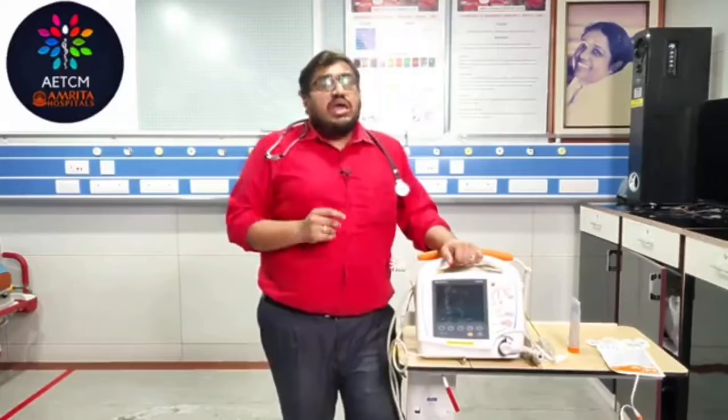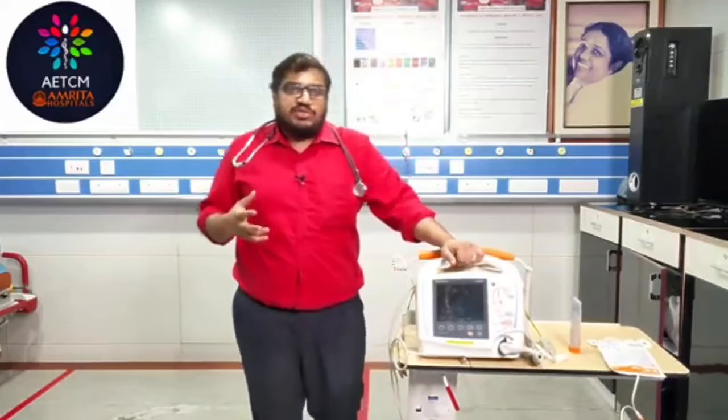So you are delivering the shock. That's it. So that is regarding your defibrillation, only in case of a cardiac arrest. Next coming is the cardioversion. Many people have a doubt: what exactly is meant by cardioversion?